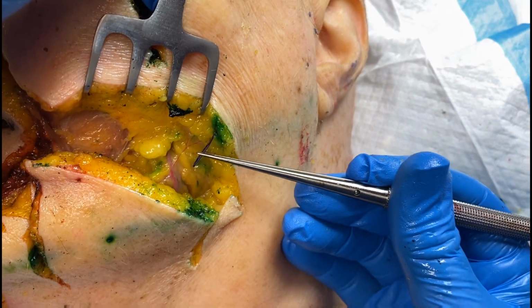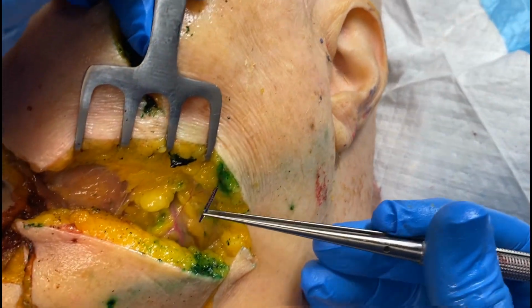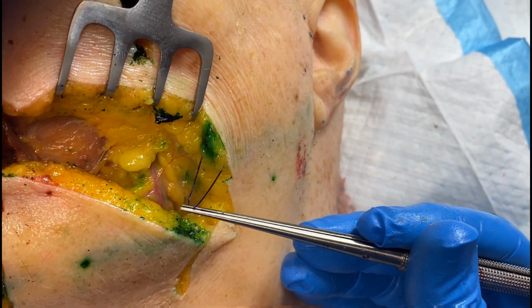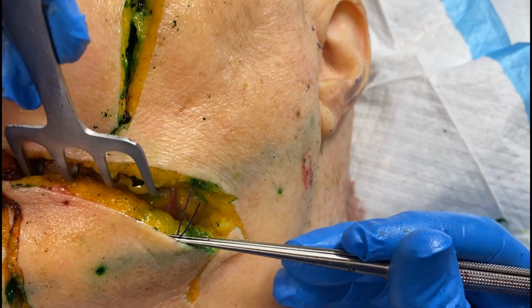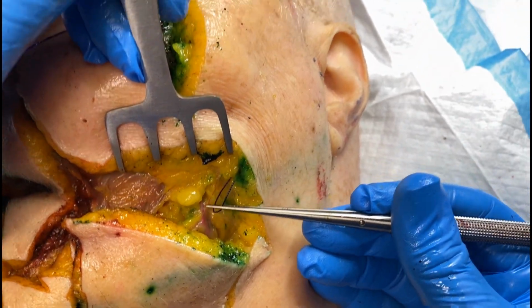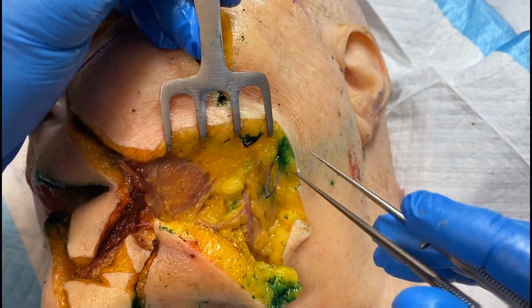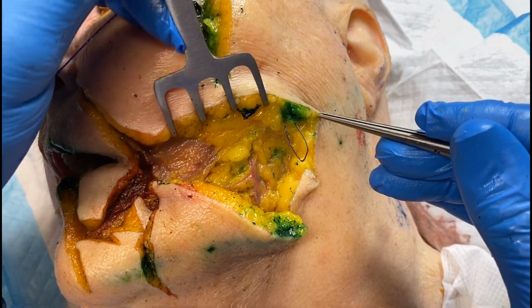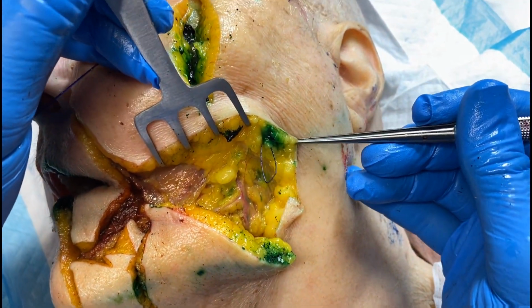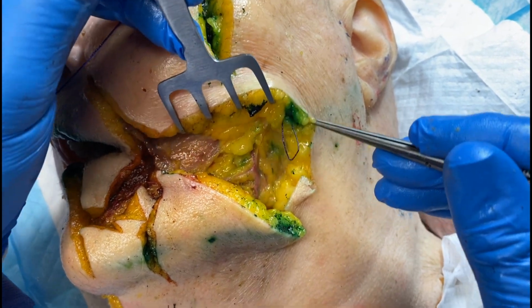And that's what's attaching. Part of what's attaching is all those barbs on the side, but when we dissected it out, you can see this doubled-over part is also attaching to the skin. But let's take a look at this cross section. Take us through this cross section here, Dr. Kimball. Now, some of the stains you're seeing are from filler that was injected as we were doing different things in the AAFE cadaver lab and some testing and experimenting today.